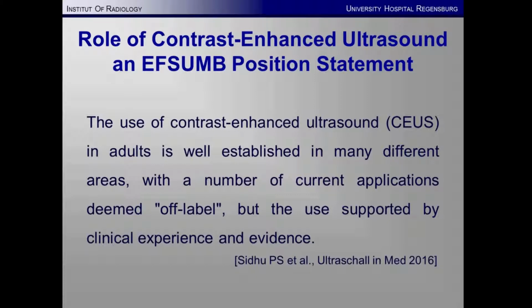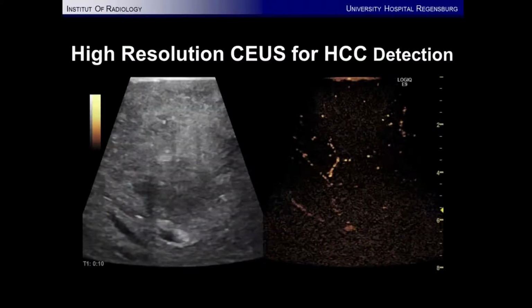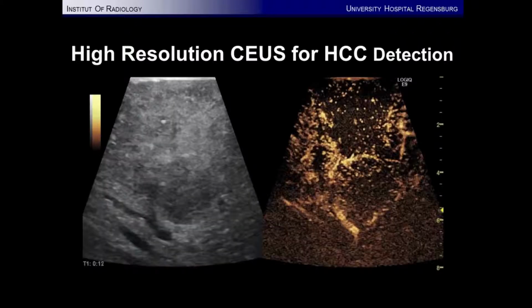What we have to discuss: normally, liver contrast-enhanced imaging is an on-label use, but using it for TACE is an off-label use, though it is very useful for our patients. So if you are an experienced examiner, use it and help our patients. What we have to learn, look at this.